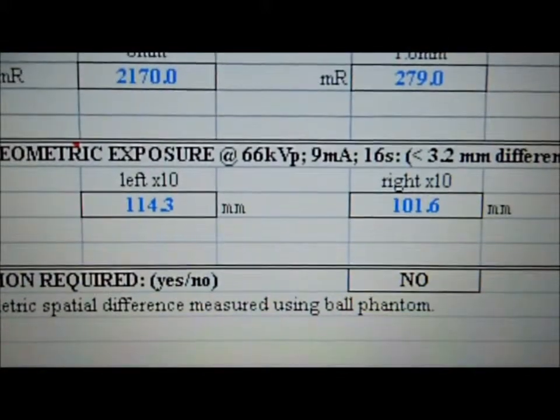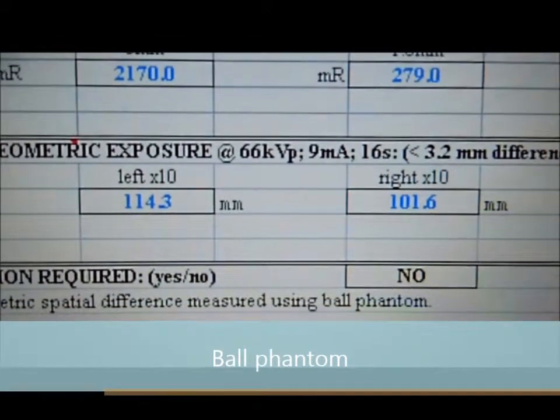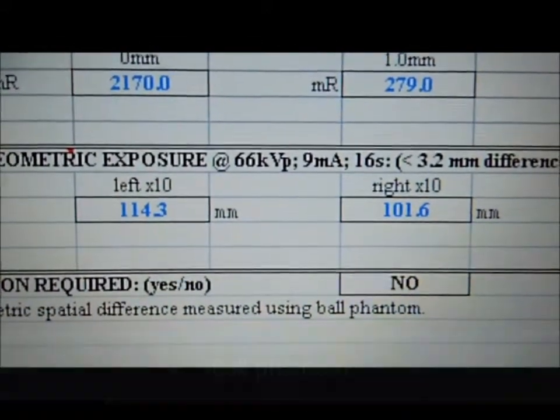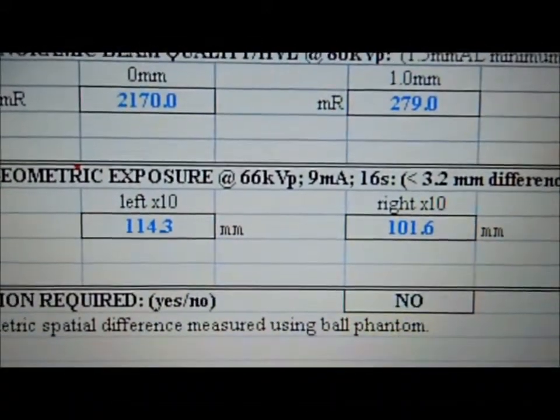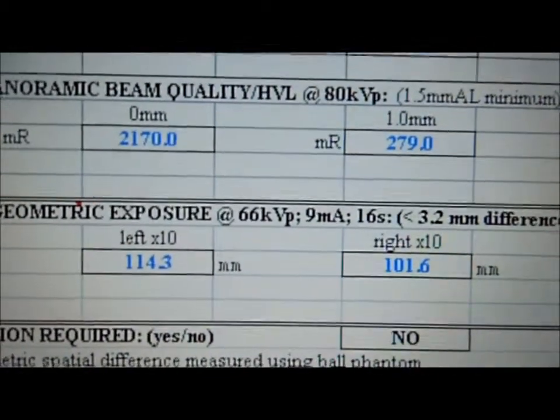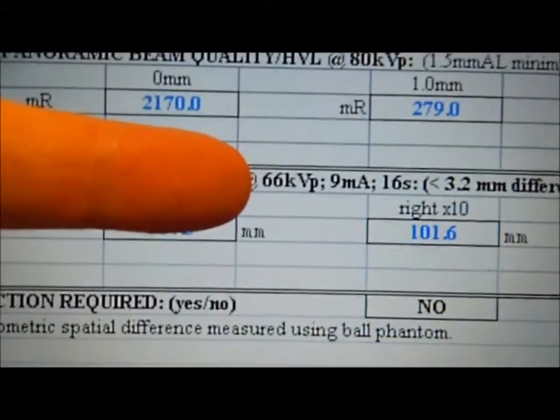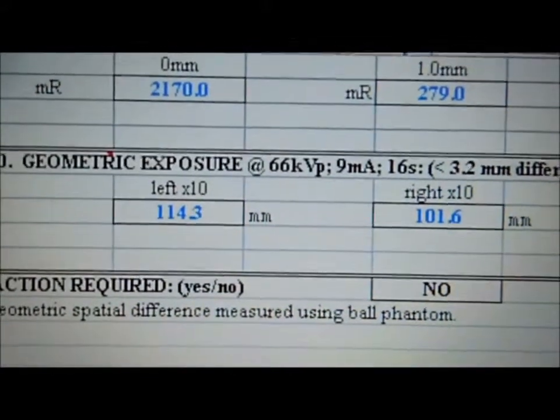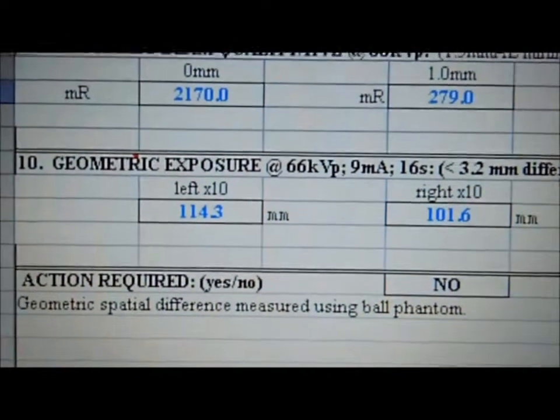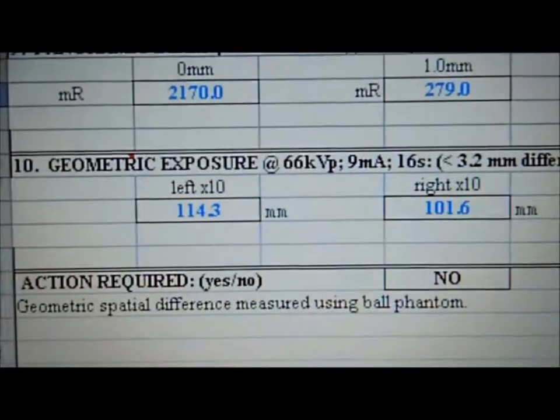Geometric exposure. Here we are using a geometric spatial phantom to measure the distances between each geometric circumference. We have a preset technique of 66 kV at 9 mA at 16 seconds with a tolerance of less than 3.2 millimeters of difference.